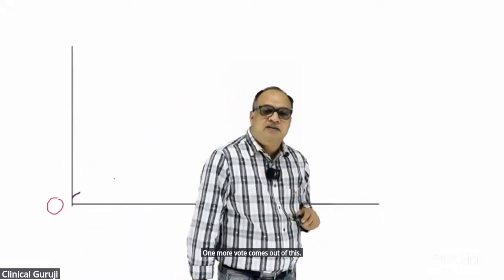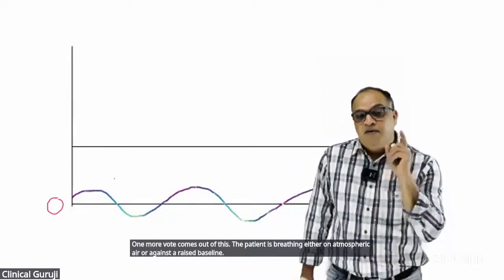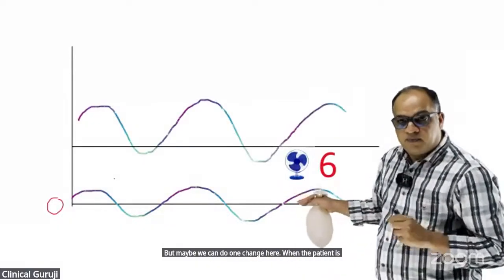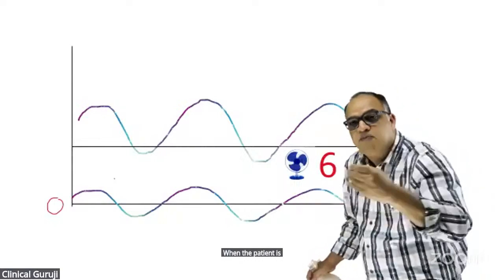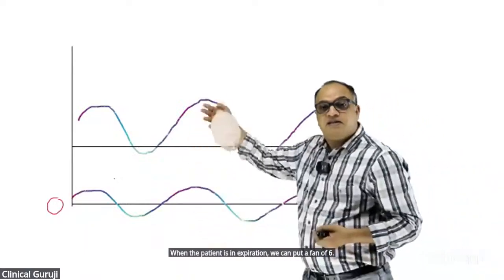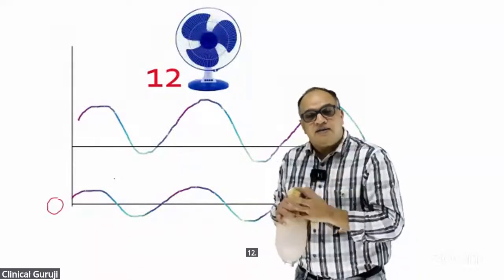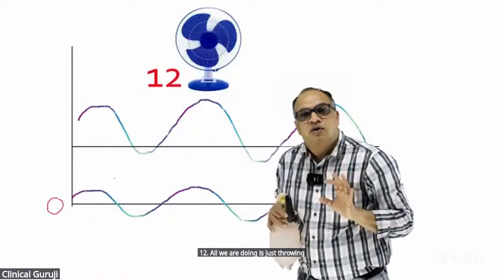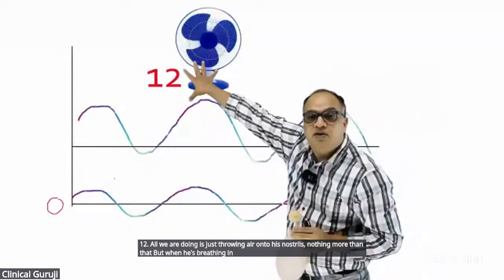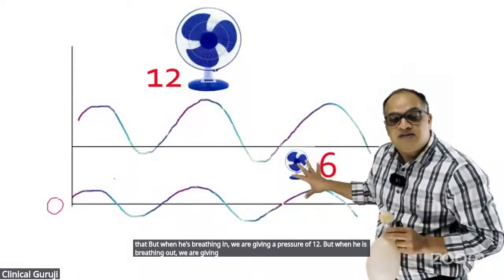The patient is breathing either on atmospheric air or against a raised baseline. But maybe we can do one change here. When the patient is breathing out, when the patient is in expiration, we can put a fan of 6. And when the patient is inspiring, we can put a fan of 12. All we are doing is just throwing air onto his nostrils, nothing more than that. But when he's breathing in, we are giving a pressure of 12. But when he's breathing out, we are giving a PEEP of 6.